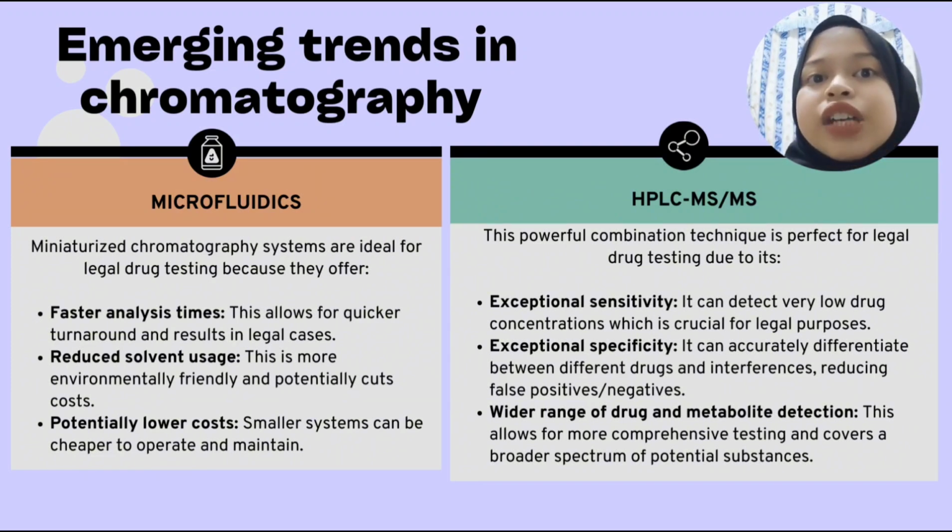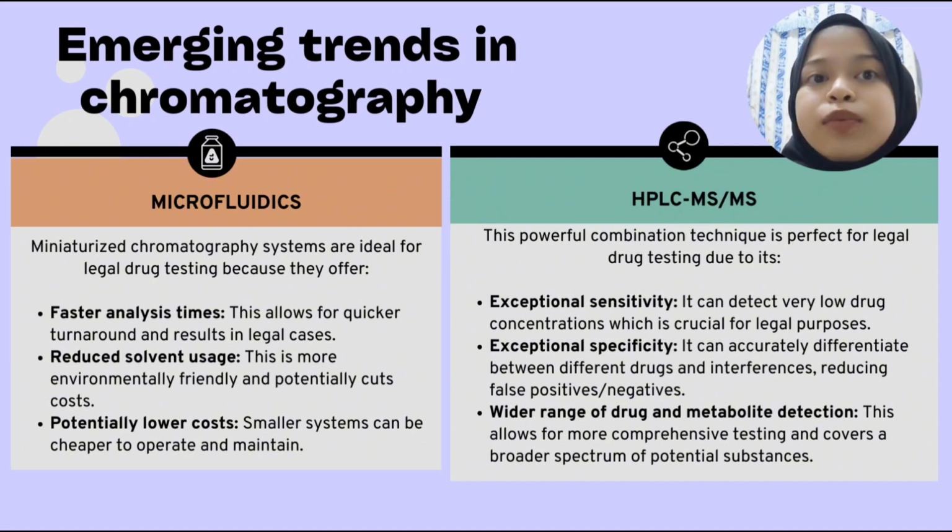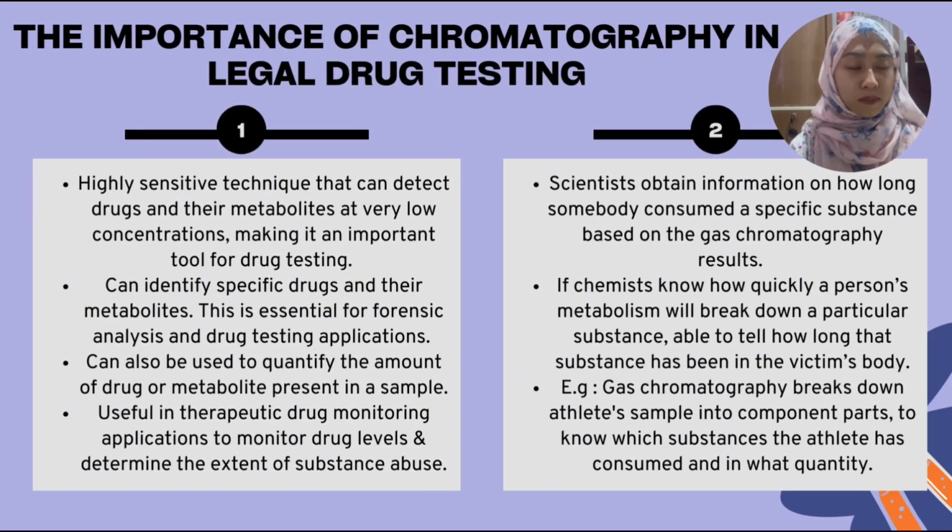Lastly, wider range of drug and metabolite detection. This allows for more comprehensive testing and covers a broader spectrum of potential substances. On to the next part, which is: what is the importance of chromatography in legal drug testing?